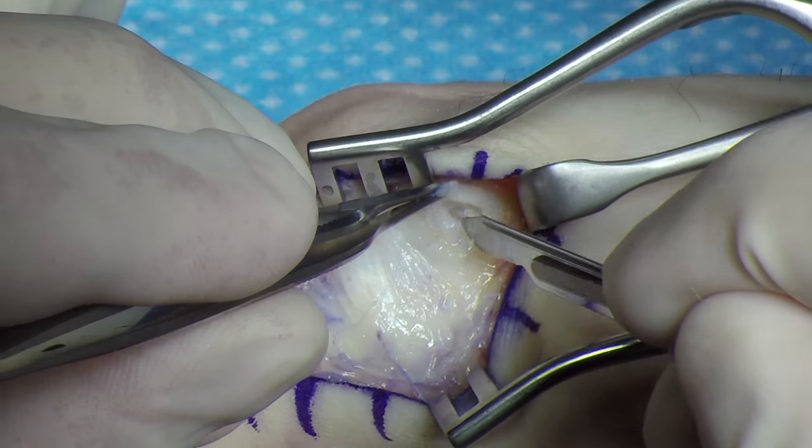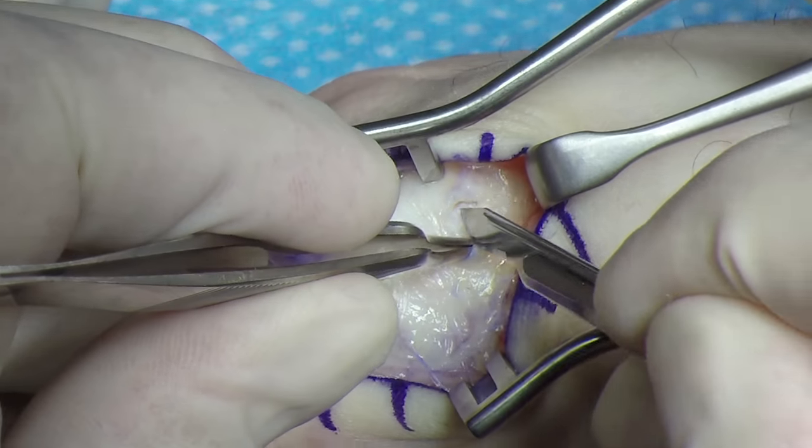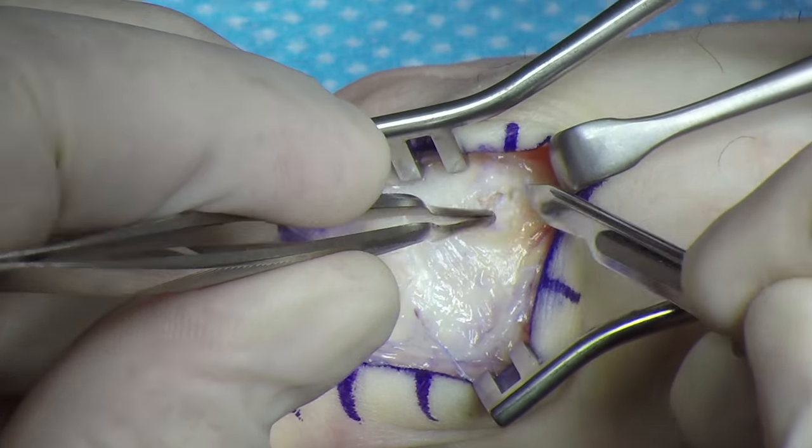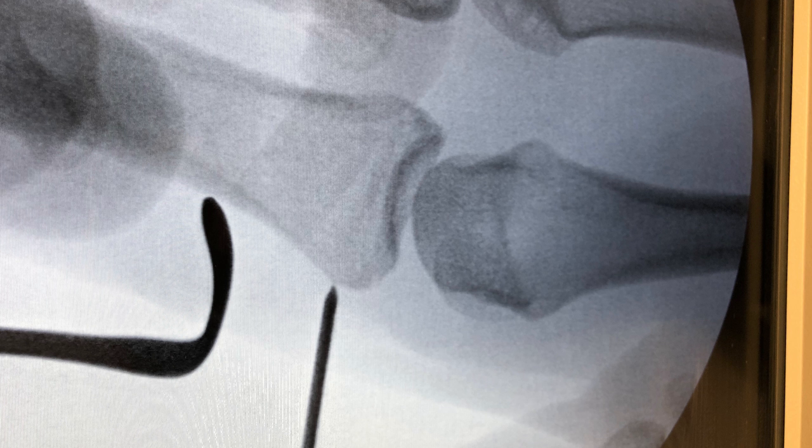A small area is cleared at the insertion of the collateral ligament on the metacarpal head. Appropriate placing of the graft on the proximal phalanx is assisted with a guide pin and intraoperative fluoroscopy.